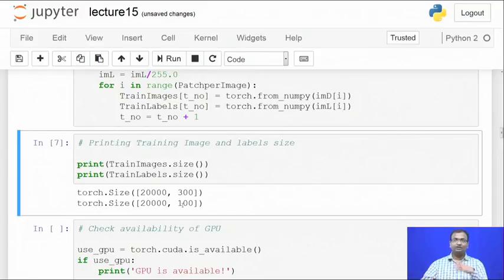One way, you can always treat this as a regression problem and train it end to end, but since we are doing it with an autoencoder, our first objective is to do an unsupervised pre-training in order to learn features and then use these features to reconstruct my actual space of all the pixel labels.